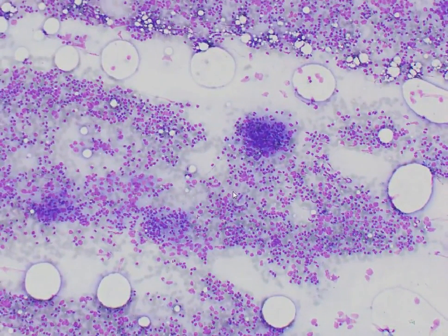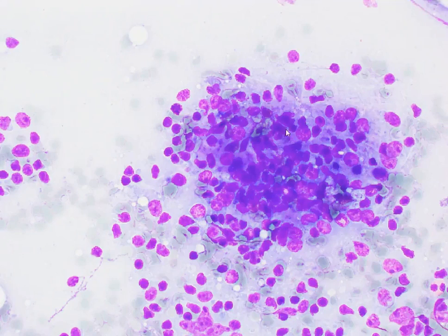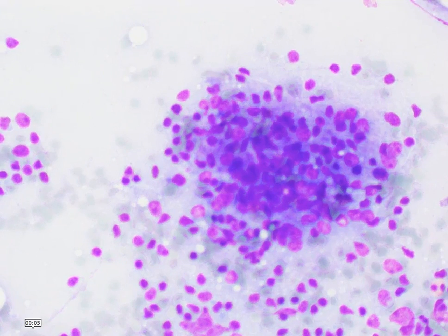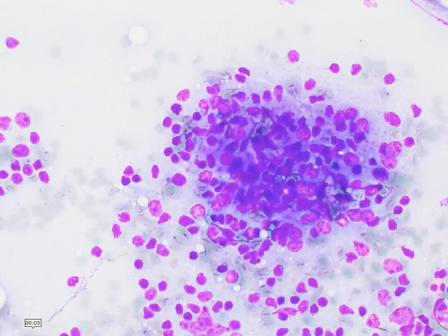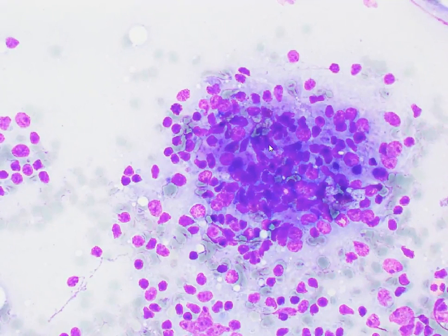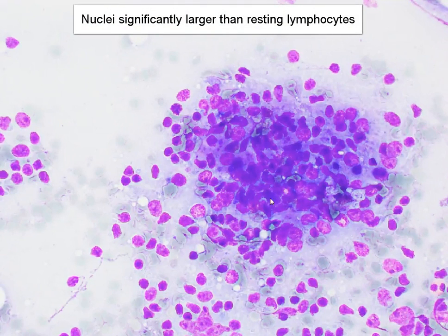There are actually not that many lymphocytes in the background. Now focusing on a group such as this, moving up and down into different planes of focus, we can see that it is composed of fairly large cells, and when you compare them to lymphocytes, they are probably around three to five times the size of lymphocytes.